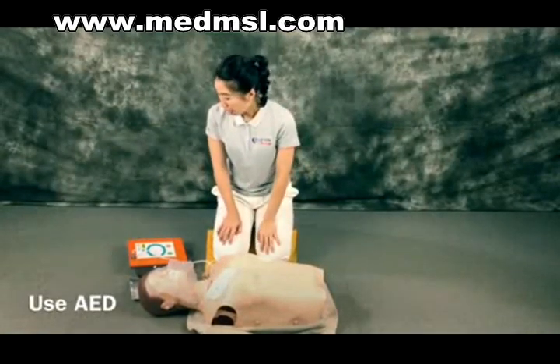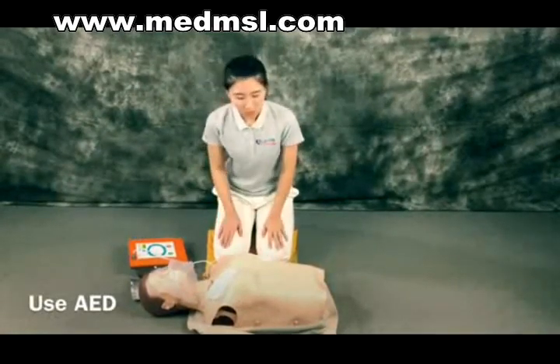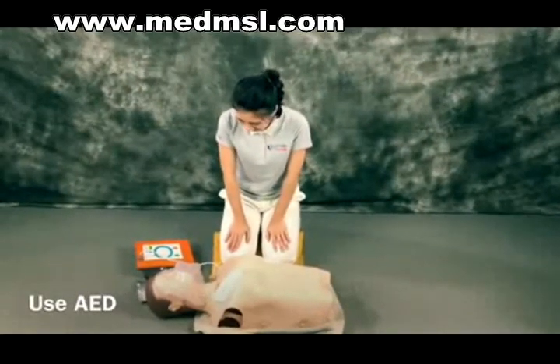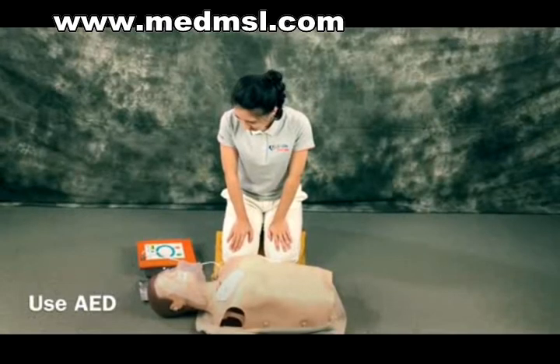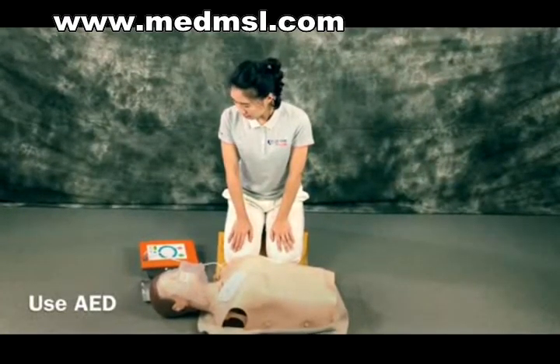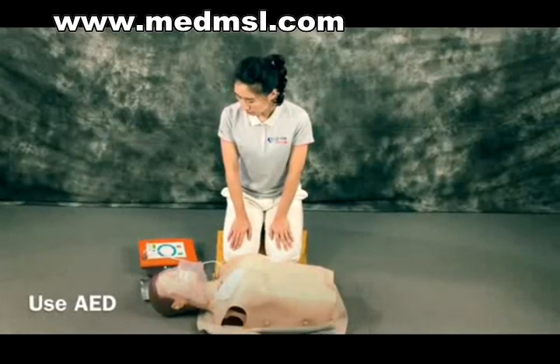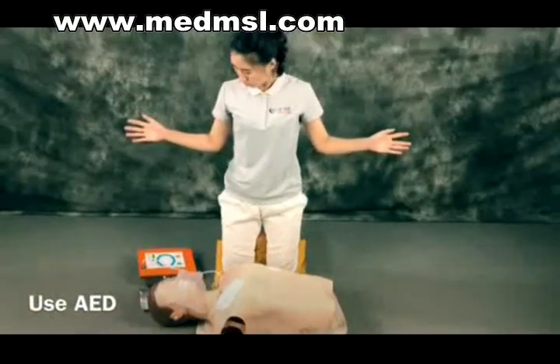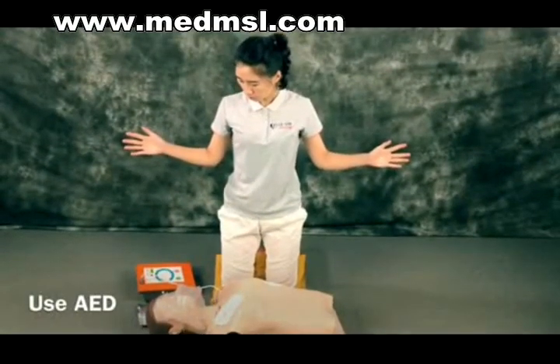Attach pads to the patient's bare chest. Plug in the cable. When electrode pads are being attached to the chest, follow the spoken and visual directions immediately. Ensure that nobody is touching the victim while the AED is analyzing the rhythm.